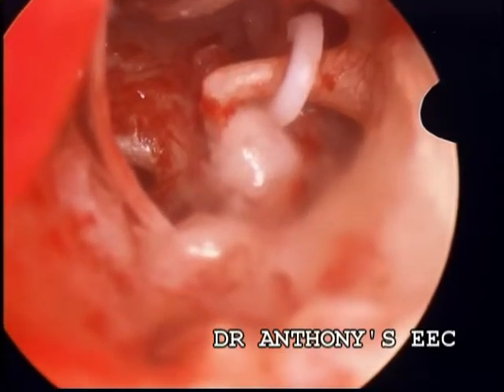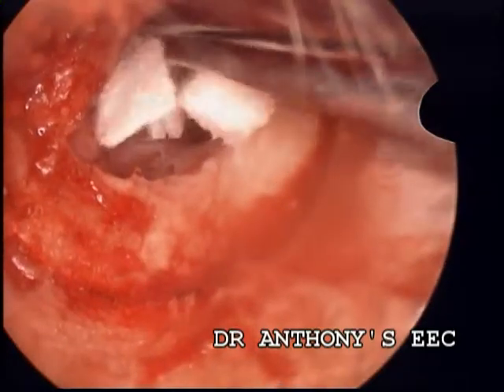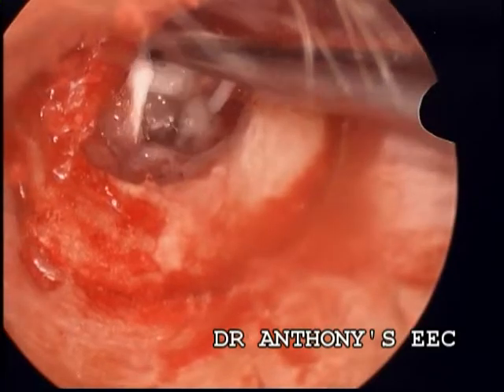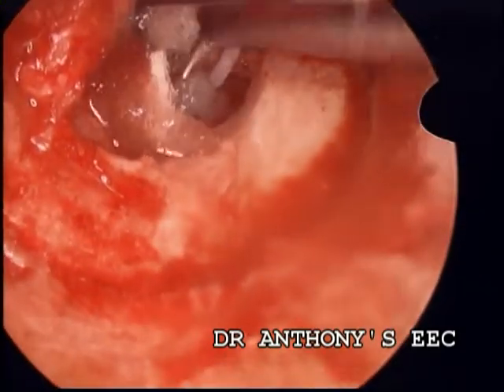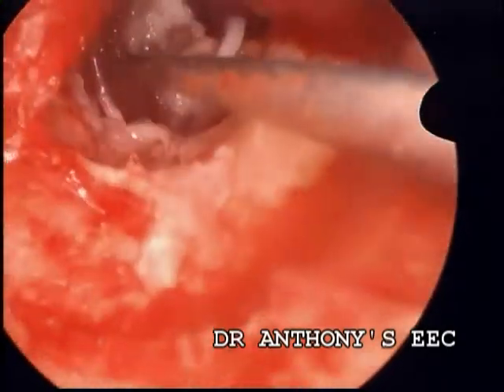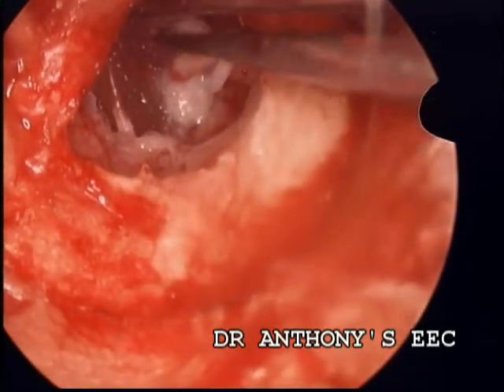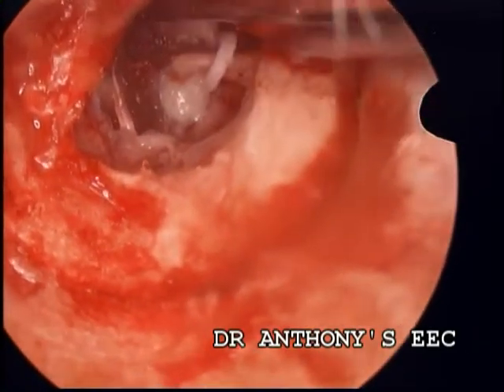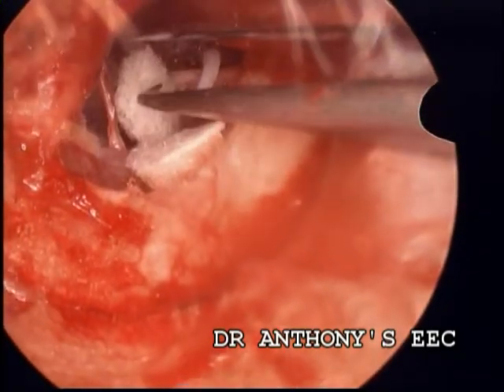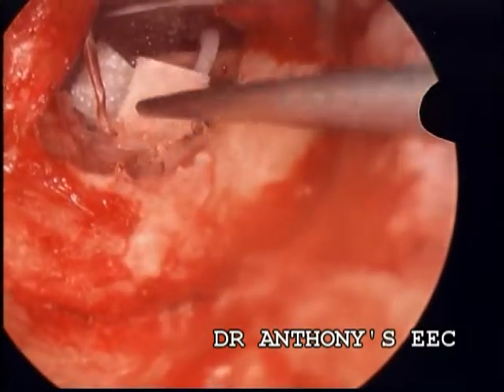Then I packed the middle ear with gel foam. Once I was happy with what was done, as we proceed, once the patient comes to a sitting posture, the anti-gusher effect which has started means the CSF-like fluid leak will reduce. If your seal is in place, it will heal off.